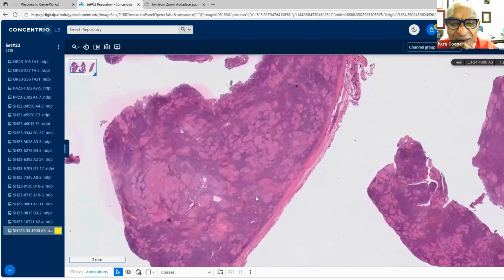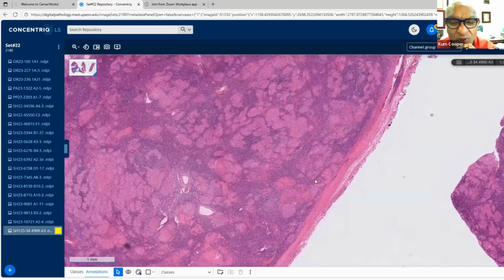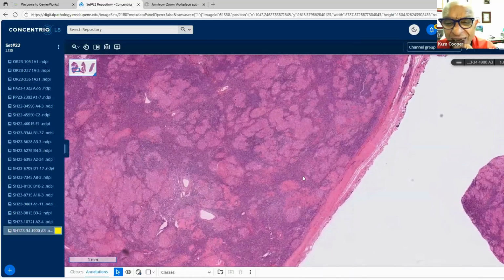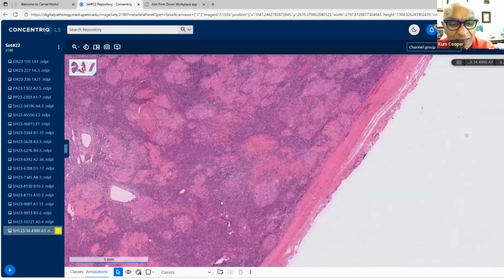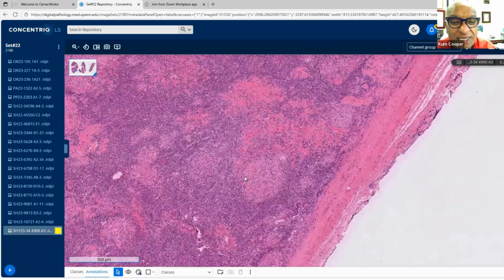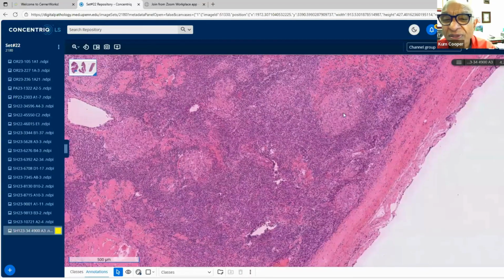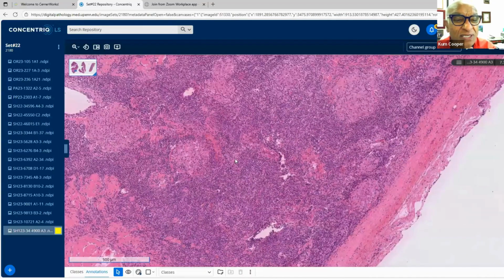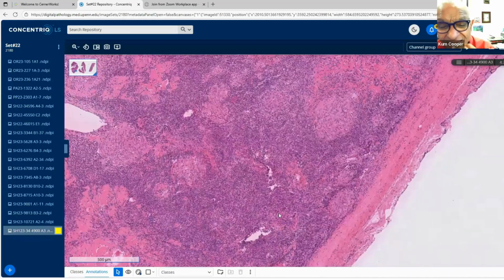Okay. And here you can see the capsule. I'll just stay with one lymph node. I don't have to go through all of them. It's a while since I looked at this, but let's see. There's a capsule, and you can see lymphoid tissue here. Some of these look like germinal centers, I think. But what you already spotted, all of you out there, are these pink structures here. All right. I know you all know what these are.